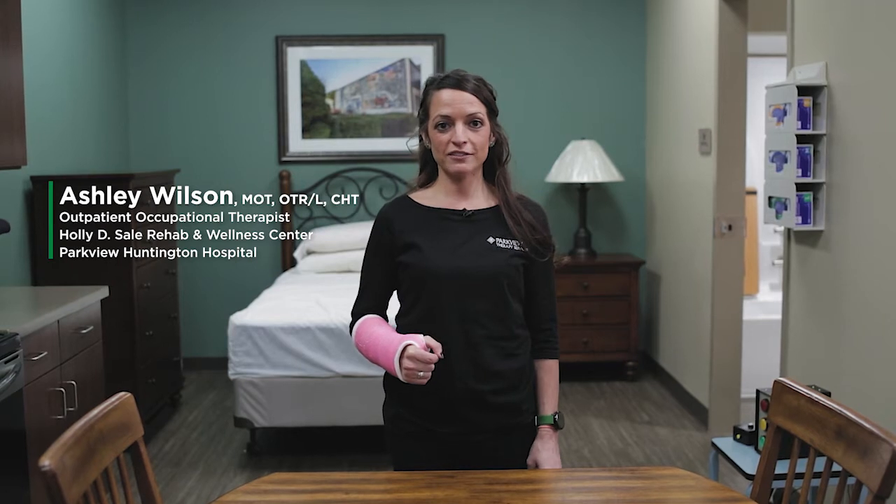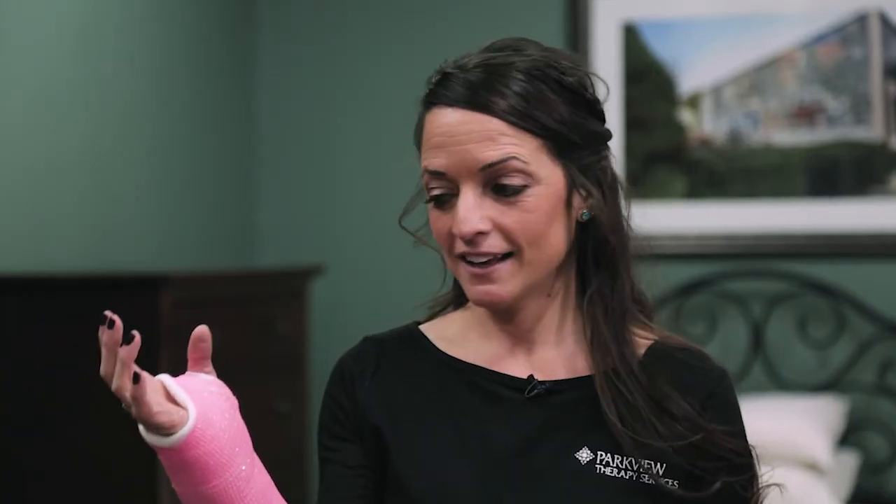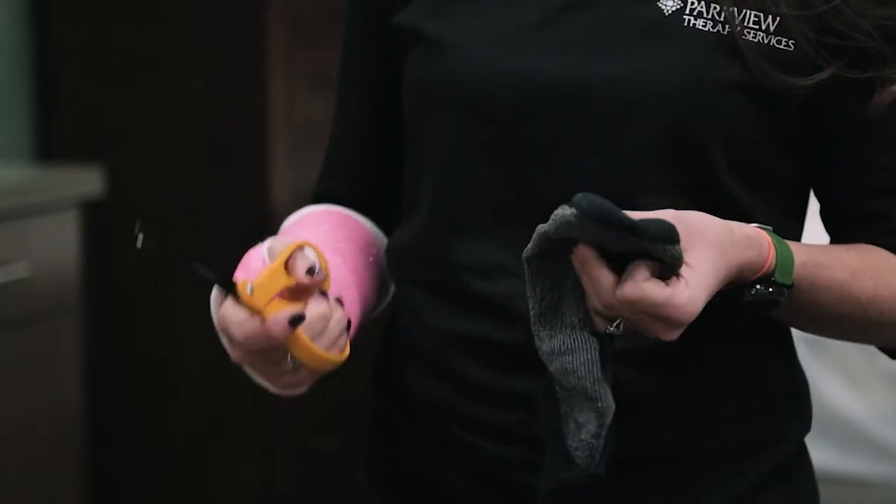Hi, my name is Ashley Wilson and I'm an occupational therapist and certified hand therapist at Parkview Huntington Hospital. Today I'm here to talk to you about cast care, like this one I have on today. We want to make sure that the cast doesn't get wet or dirty.